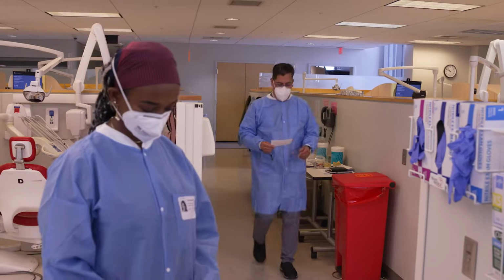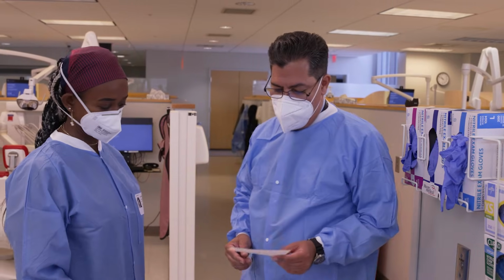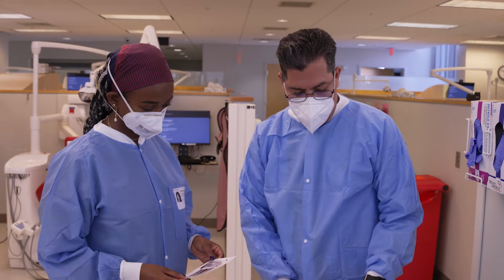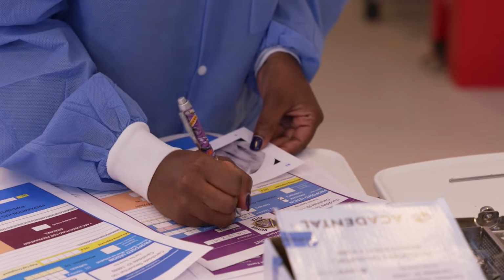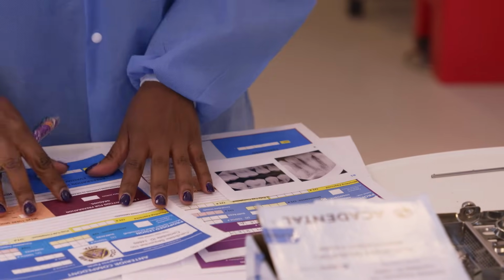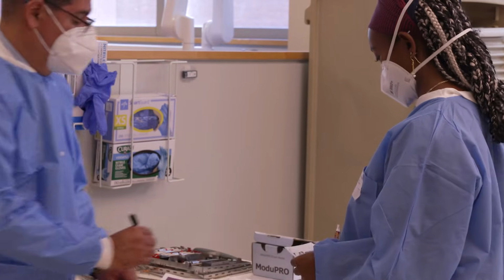For this exam, you will be asked to diagnose and treat 2 lesions, one anterior and one posterior. A clinic floor examiner, or CFE, will present you with 2 radiographs. Each image will only have 1 lesion present. Evaluate the radiographs and diagnose both anterior and posterior lesions. Record your treatment plan on the anterior and posterior progress forms and present them to the CFE.